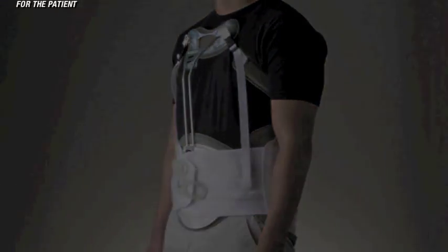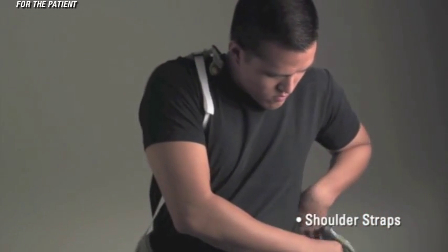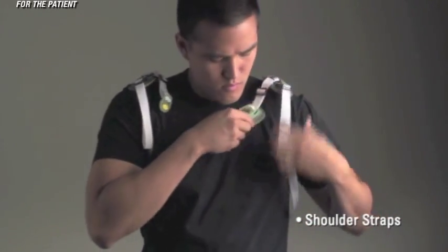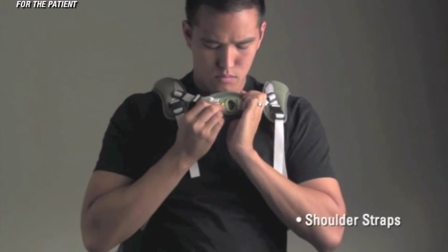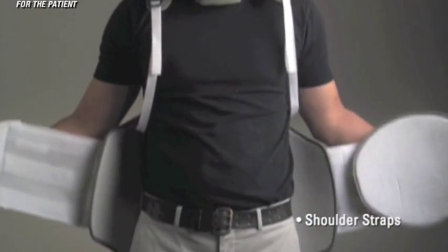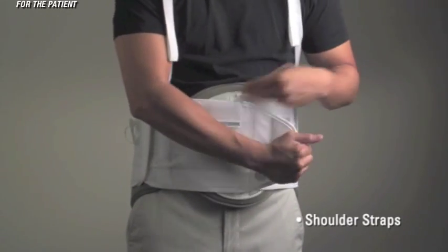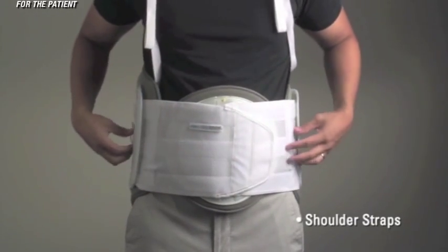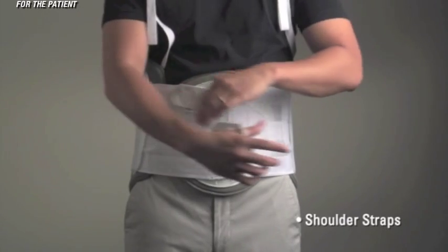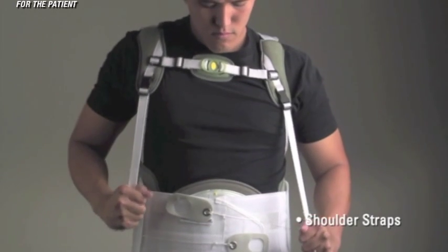Beginning with the shoulder strap option: apply the brace like a jacket, sliding both arms through the shoulder straps. Attach the horizontal chest strap by inserting the male end into the female connector. Pull on both ends of the Contour T LSO firmly. While holding the left side against the body, overlap with the right side so the Velcro mates. Once the brace is properly positioned, peel the pull tabs away from the brace, compress, and touch down pull tabs. Pull down on the shoulder straps to get a snug fit.